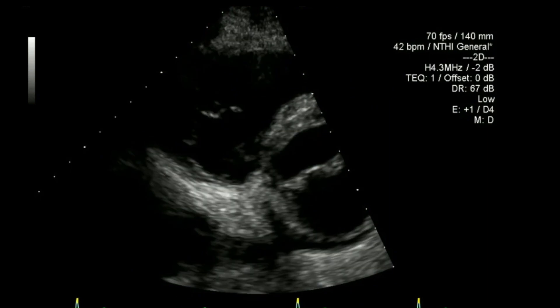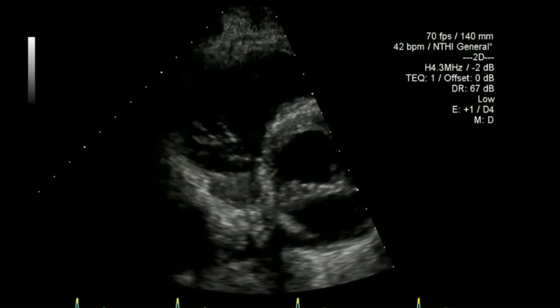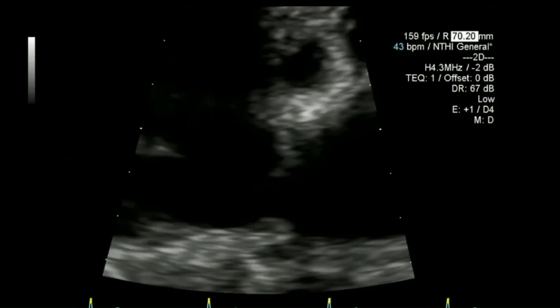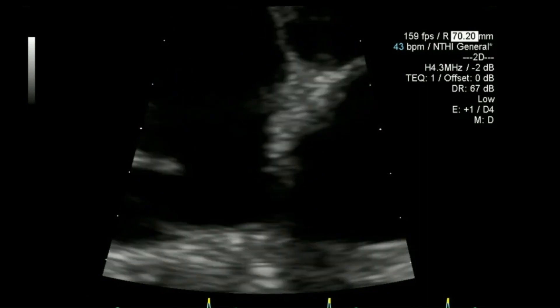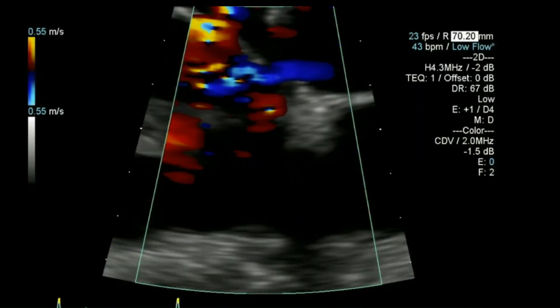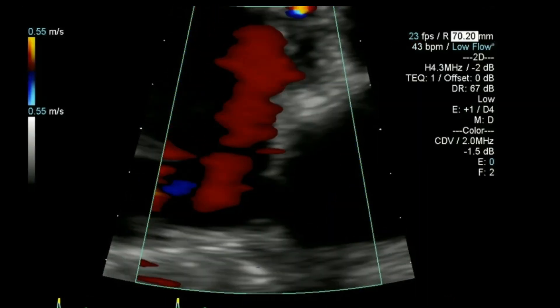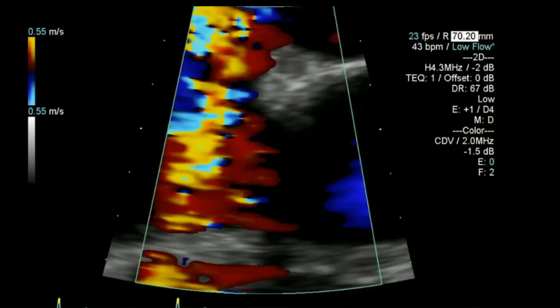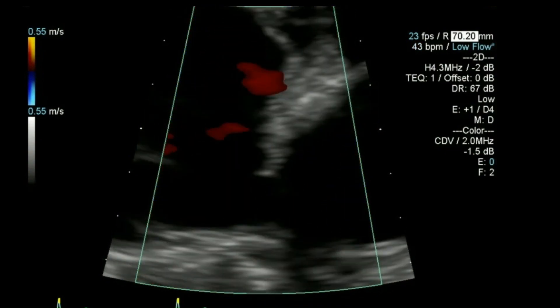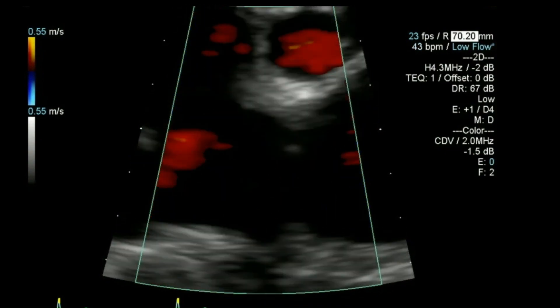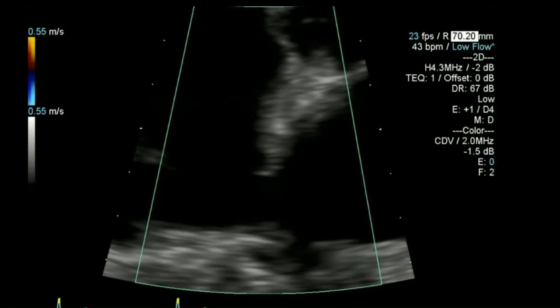And that's a view of the tricuspid valve. Then I'll zoom up on the atrial septum and using a lower colour scale I will look at the actual atrial septum there, considering PFO or atrial septal defect.